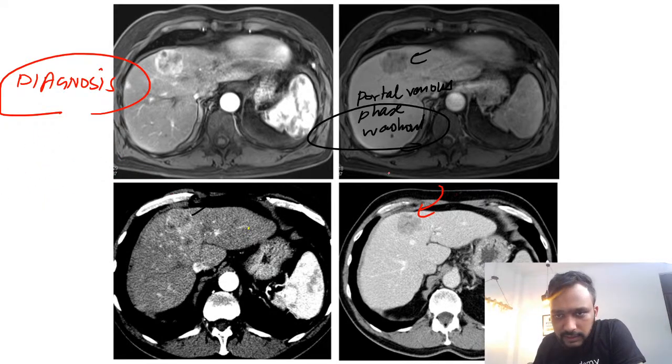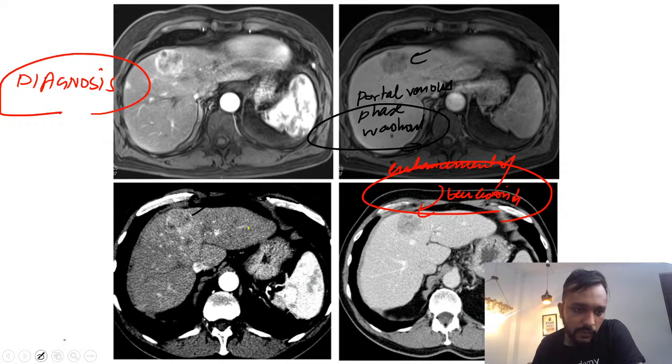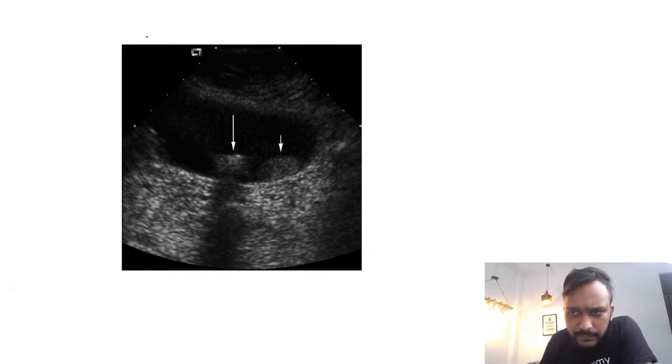So this will be a case of hepatocellular carcinoma.